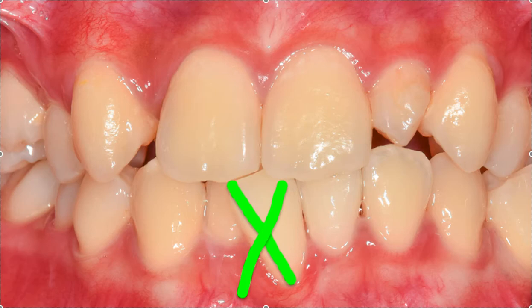But basically, in a nutshell, this is one of the cool tricks you can do with Invisalign: you can ask the case to start with 1 or 2 passive aligners. Passive aligners mean we're not moving anything. It's just like a dummy, like a retainer, basically. If you start with 1 or 2 passive aligners and then do the active movement attachments, say at aligner 3, then at delivery you can officially start the case, in air quotes.